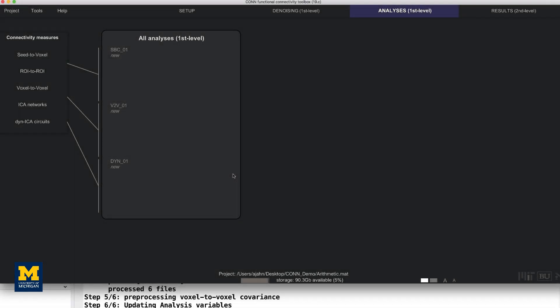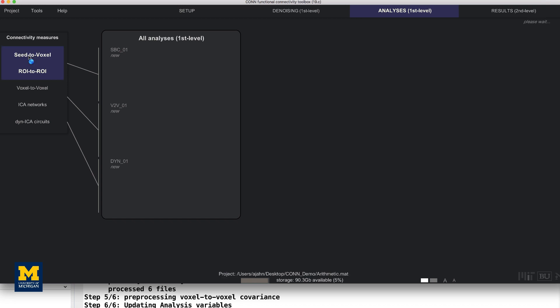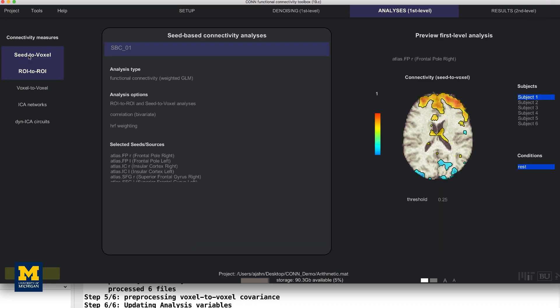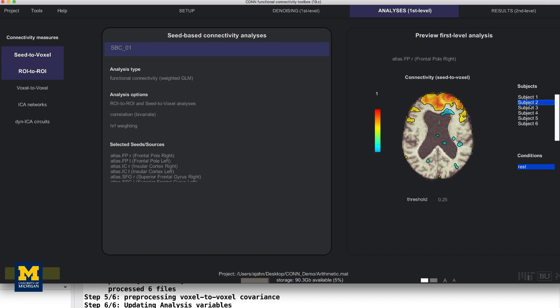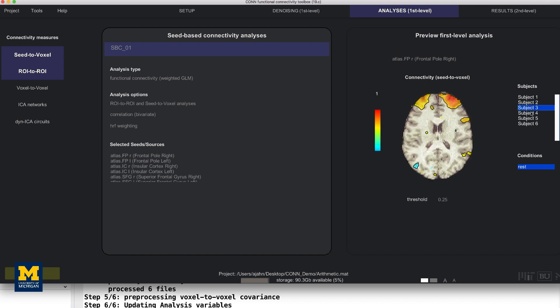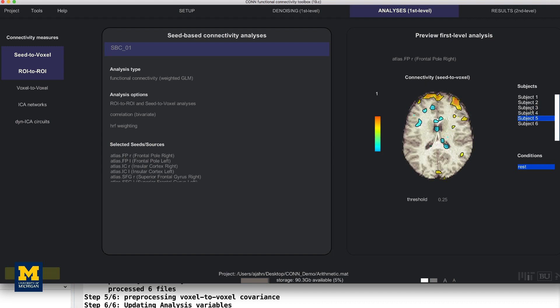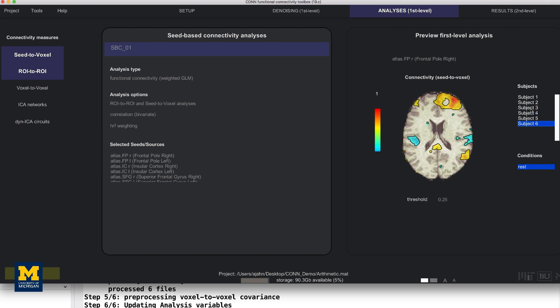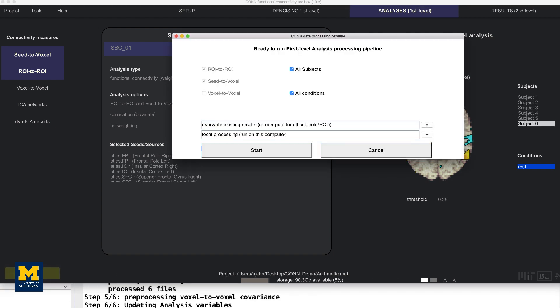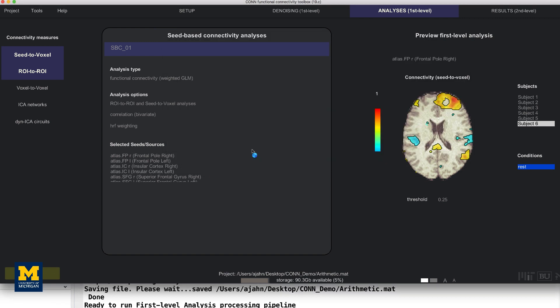When it's done, the preview window of the tab analysis first-level will be the same as for the individual subject analysis, but now with all of the subjects listed. Click through them all to review their connectivity maps after denoising has been performed. If you are satisfied with the quality checks, click on Done to begin the second-level analysis. Make sure that all subjects and all conditions are checked, and then click Start. This will only take a few minutes.